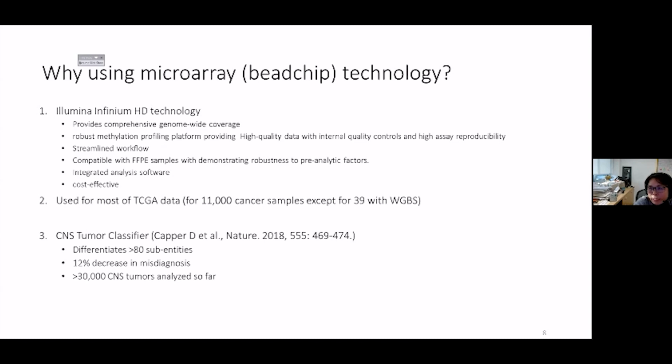So why choose the Illumina methylation EPIC array for DNA methylation profiling? Sometimes they call it the methylation array, or sometimes the EPIC array. It's the same thing. There are a variety of methods that exist to quantify DNA methylation, each with various applications in clinical oncology, for example restriction endonuclease digestion, affinity enriched methods, and whole genome bisulfite sequencing. Although whole genome bisulfite sequencing can quantify the methylation state of about 29 million CpGs in the human genome, it is currently extraordinarily expensive and computationally intensive. So a comprehensive and cost-effective alternative is the complementary use of bisulfite converted DNA and microarray technology.